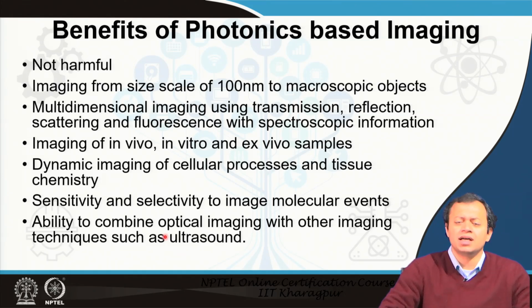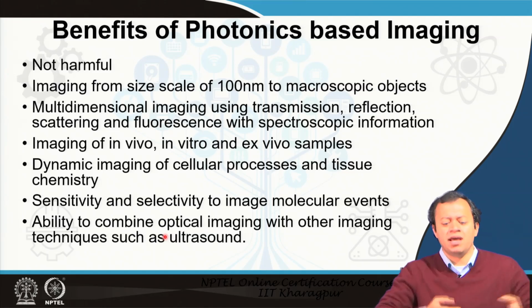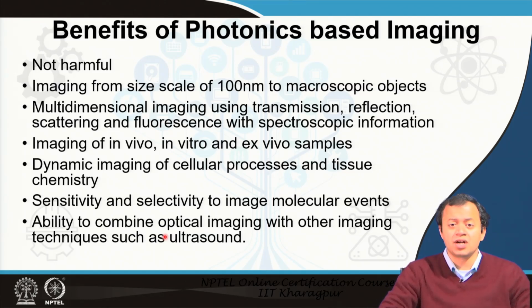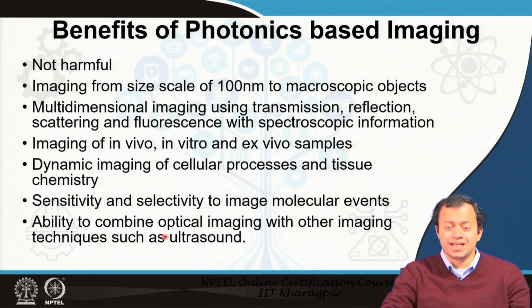It can combine with other types of images and you can overlap two or three different types of images. The same brain, the same tumor inside the brain, has been taken by MRI, by CT scan, perhaps ultrasound, and then you try to do some kind of an optical biopsy of that, to get a whole, complete picture of what exactly is going on.